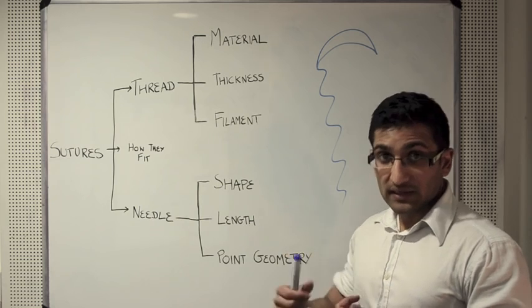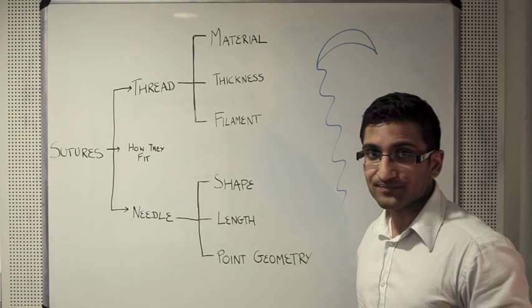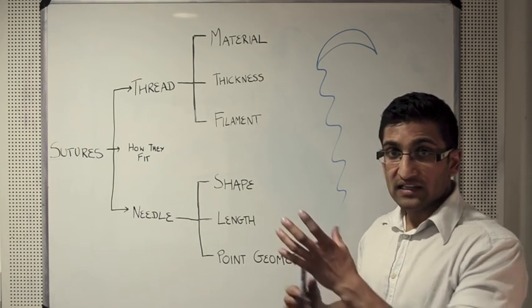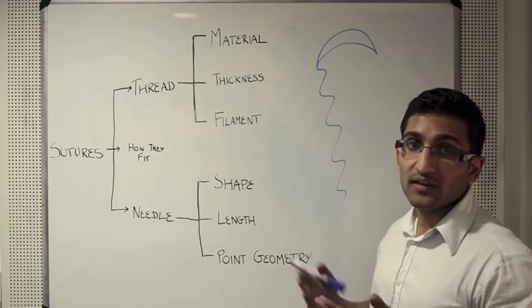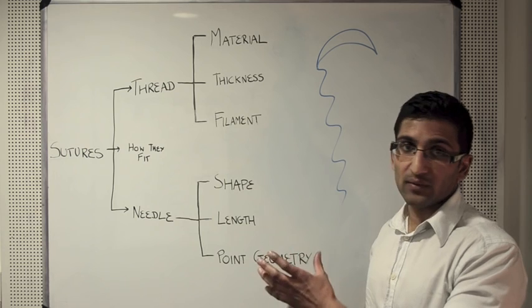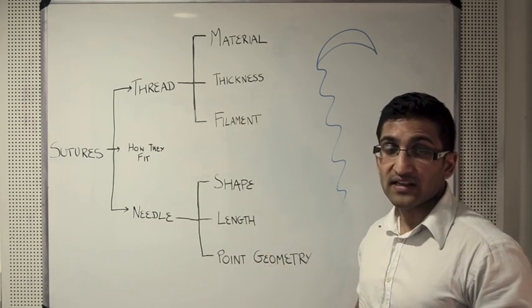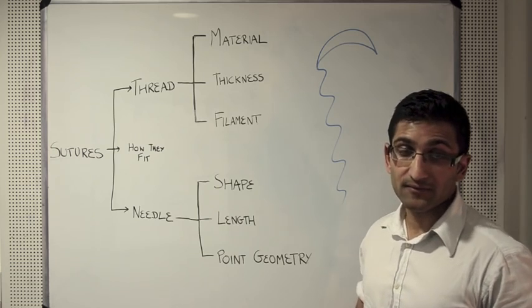It takes longer to thread a needle. There's increased risk of needle stick injuries as the operator tries to thread a needle. And also, the needle has to be larger to accommodate a thread, and therefore it's more traumatic. The only key advantage of unswaged needle, however, is the fact that you can customize the needle with the thread. But due to the vast advantages of swaged needles, this tends to be the preferable method nowadays.